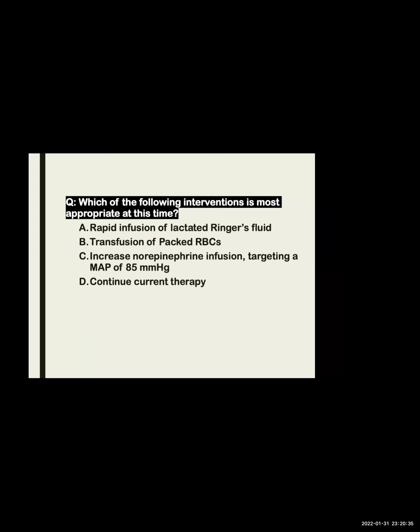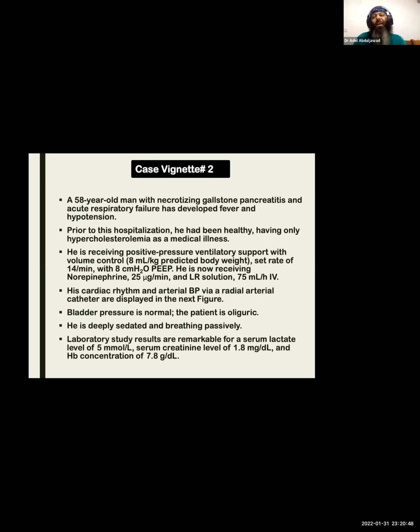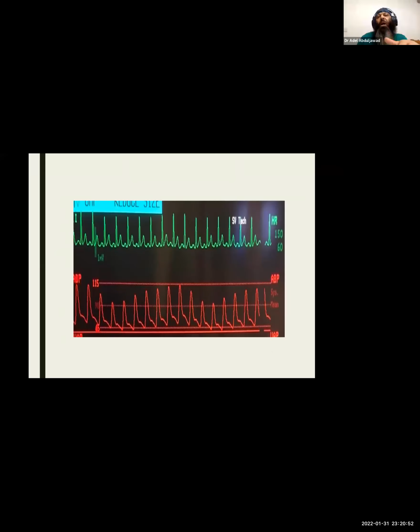Excellent, Dr. Mohammed. I'm very glad for your correct answer. Excellent. This is how the intensivist interprets the data on the monitor and the data they were given. So Dr. Mohammed read the scenario carefully, then found that the patient had hypovolemic or septic shock, and he looked at the monitor and noticed that the patient is tachycardic.